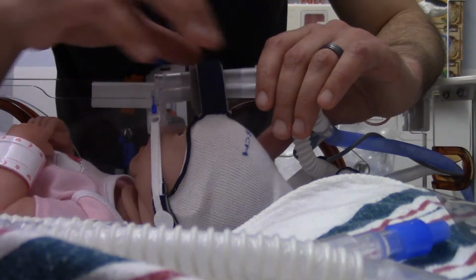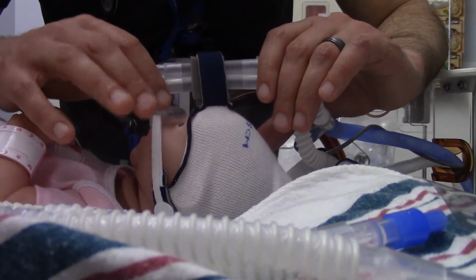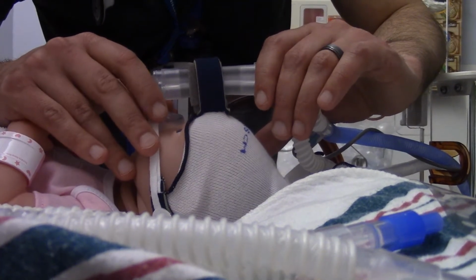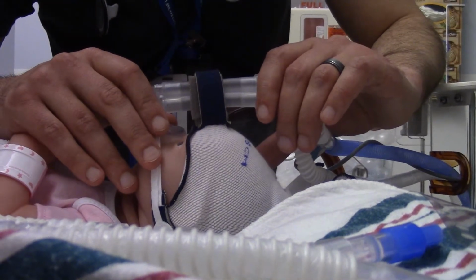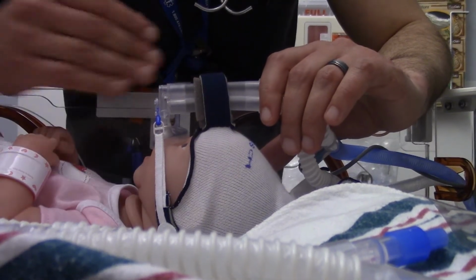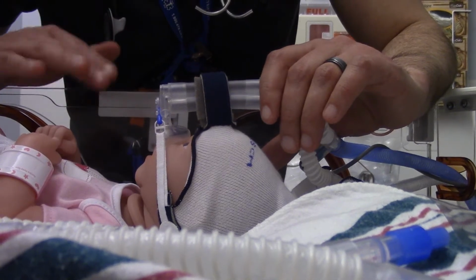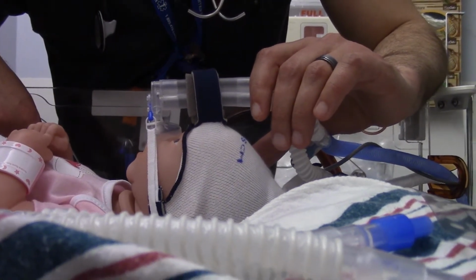Okay? So these little points make or break your day, and they also make or break it for the baby. A baby's going to cry, a baby's going to act the way that we would hope a baby would act when they are in the most comfort that they can. Remember, they don't know that they need this until they need it in an emergency situation.